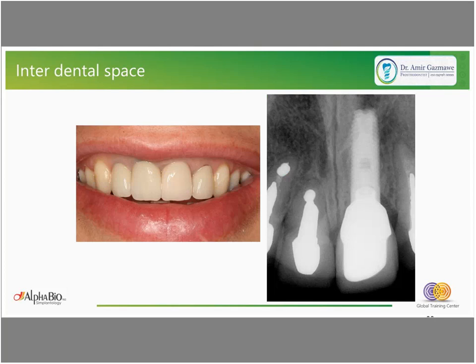This can show the good integrity of the soft tissue, the papilla preservation, and of course we can get a very good stability of the restoration and the soft tissue, which has a very big influence on the aesthetic outcome of the restoration.